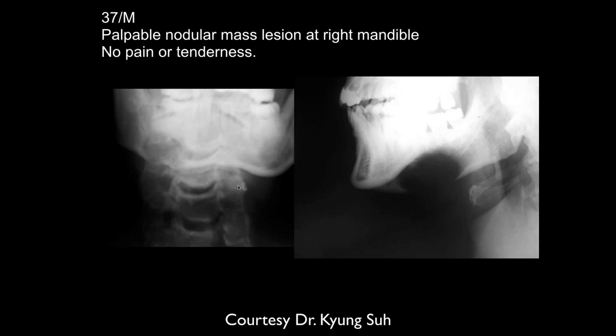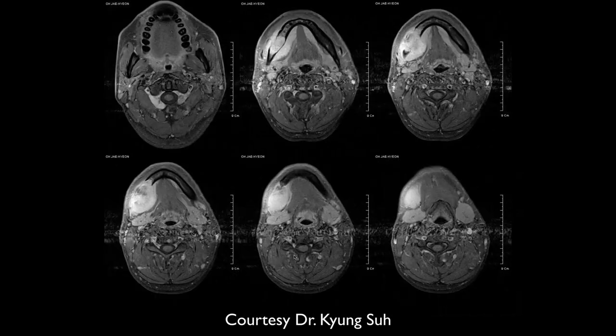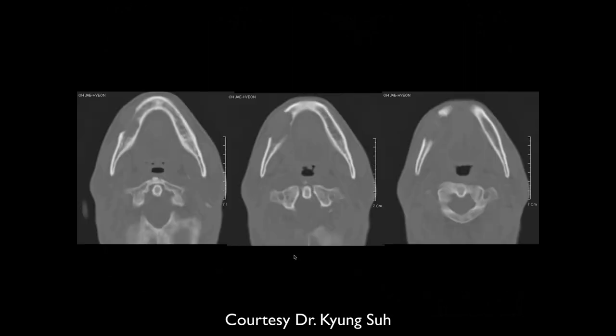There's a large lytic lesion of the mandible. I said, what, is there tenderness? Well, my first thought would be it's destroying the bone. I think some of the cortex is actually gone here. So I would think first of malignancy. Well, here, the margins look kind of expanded, but more sharply defined. But again, the cortex is destroyed, at least. Yeah, it's destroyed there. A sarcoma, yeah.